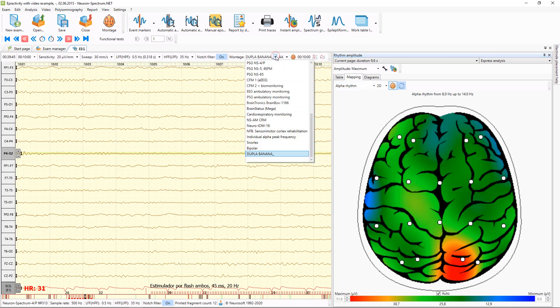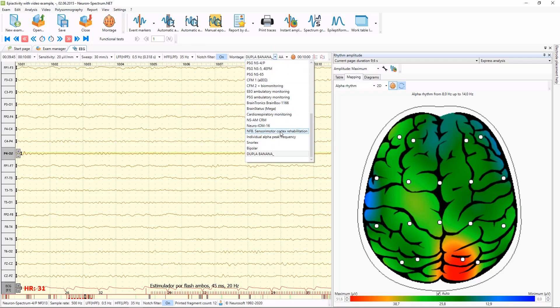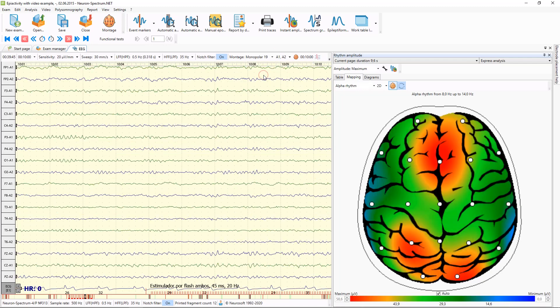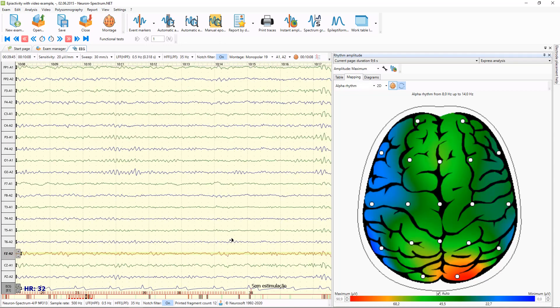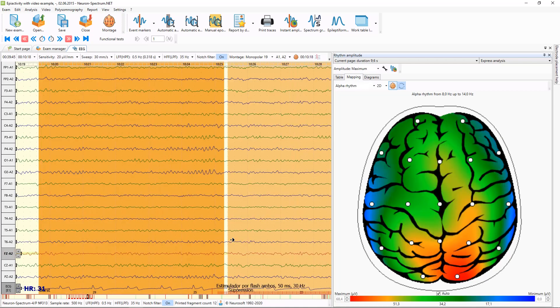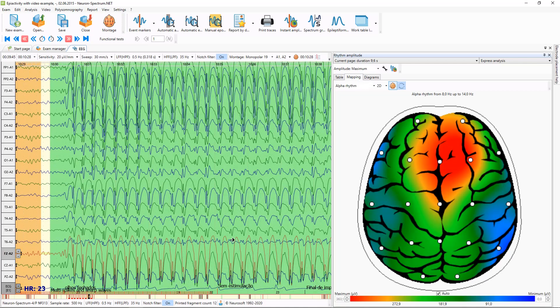To make it more clear, we can select another montage — for example, Monopolar 19. Here we can see that the Alpha rhythm is bigger in occipital derivations. On the FZ derivation it is untypically higher because this patient is ill and has epileptiform activity.